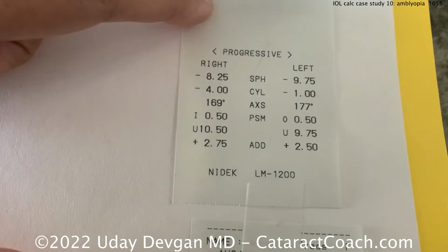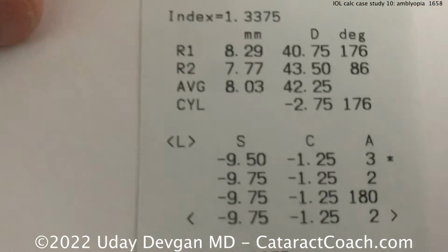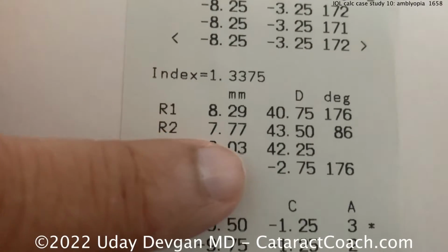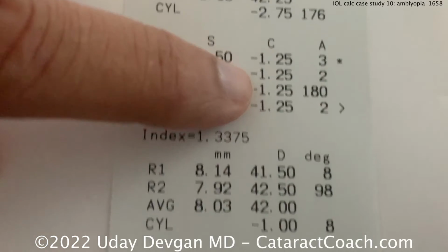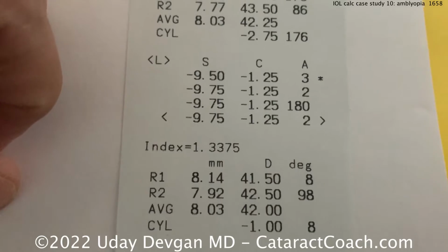So even the old glasses that we look at, 4 diopters of astigmatism in the right, 1 in the left. And we'll look at the autorefraction that was done as well. So similar here, right eye, about 3 of cylinder here, and you can see it's all in the cornea. Left eye, a lot less astigmatism, and again, that's just in the cornea. So a lot of anisometropia, but not in terms of spherical error, but rather astigmatism.